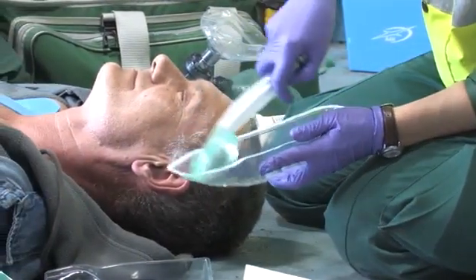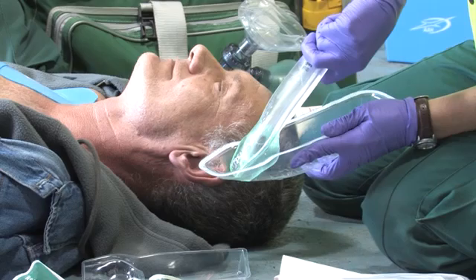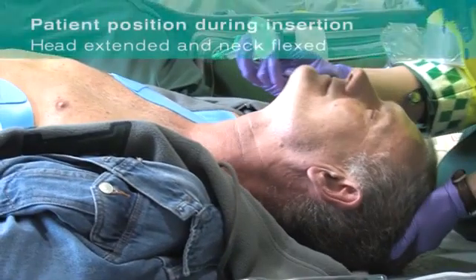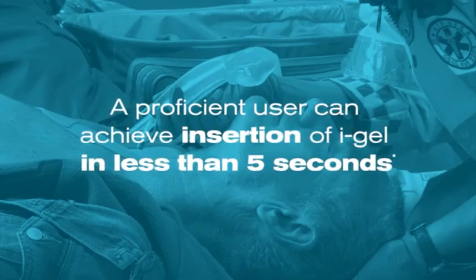Touching no lower than the bite block of the Eye Gel O2, lubricate the back, sides and front of the cuff with a thin layer of lubricant. Ensure any excess is removed. Grasp the lubricated Eye Gel O2 firmly along the integral bite block. The ideal patient position for insertion is with the head extended and the neck flexed. But if this is not possible or is inappropriate for the patient, Eye Gel O2 can be inserted with the head in a neutral orientation. A proficient user can achieve insertion in less than 5 seconds.